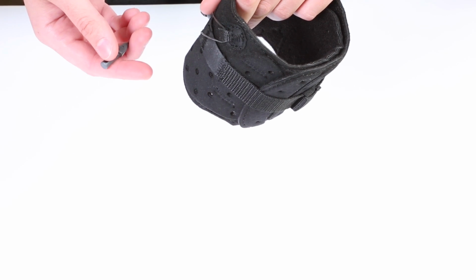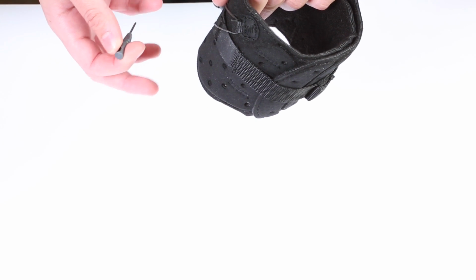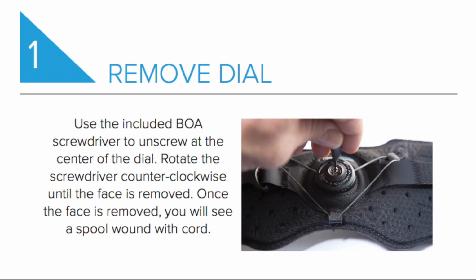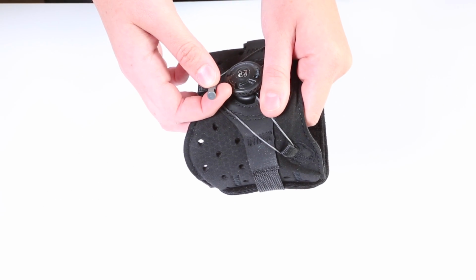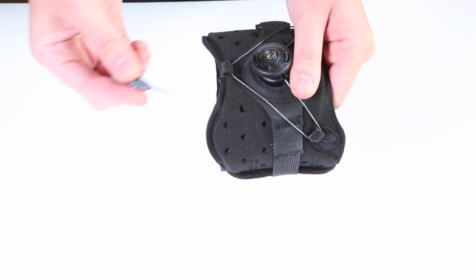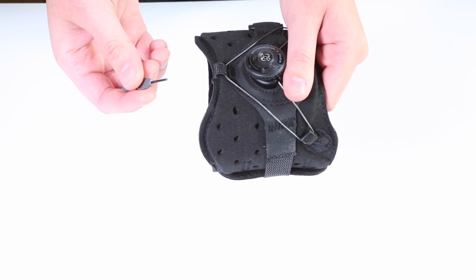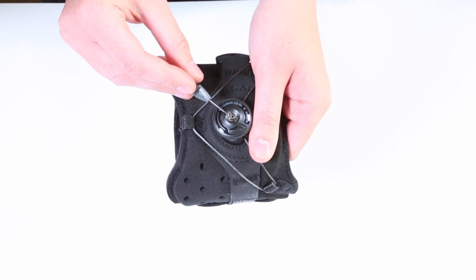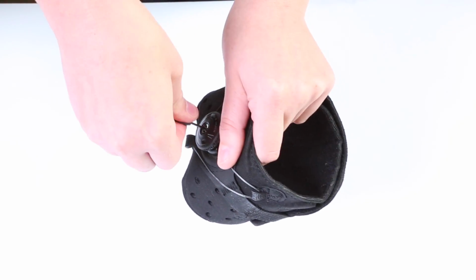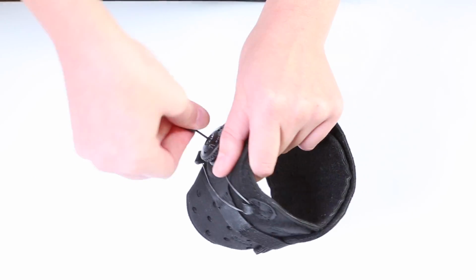So following the instructions that come with your replacing the Spectra cord kit, we're gonna go through step by step. So step one, we're going to remove the dial. Now your kit came with the BOA screwdriver. This BOA screwdriver is the same as a Torx T5, which you might have in your toolbox. So our BOA dial that's on the front of the brace, we're gonna put that screwdriver straight into the dial and loosen that up.